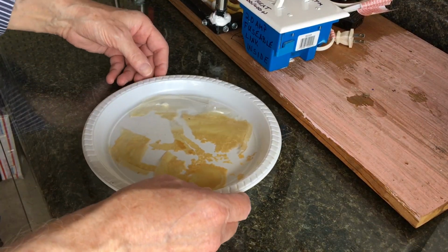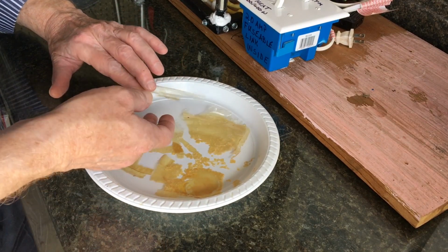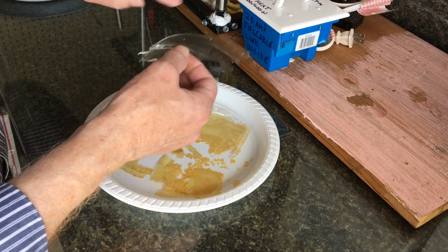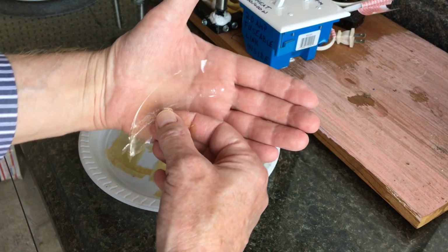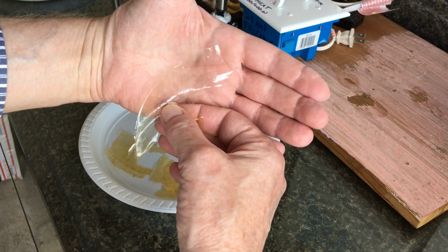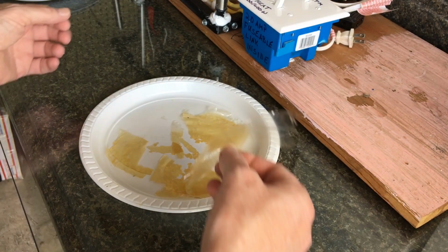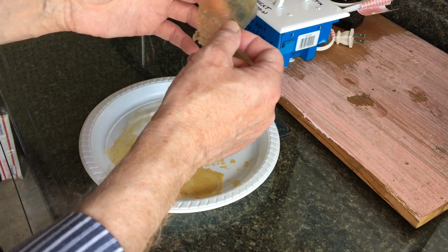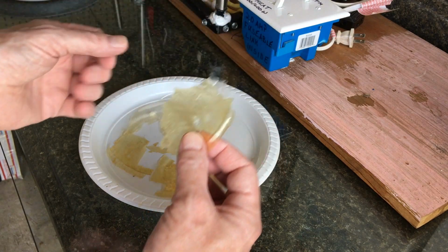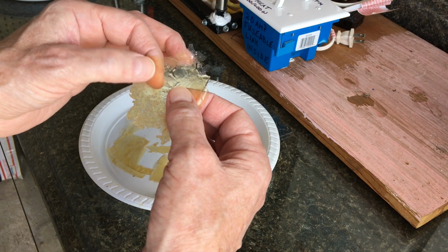So let's look at this more closely. Here's the clear part. Very nice. Very nice. But if you try to pour it too thick, you're going to end up with this. It just takes too long to dry.